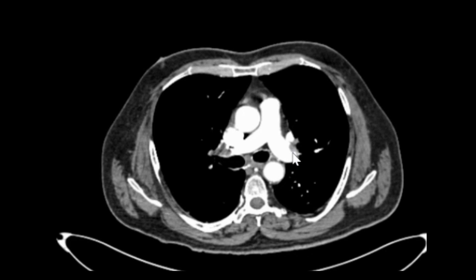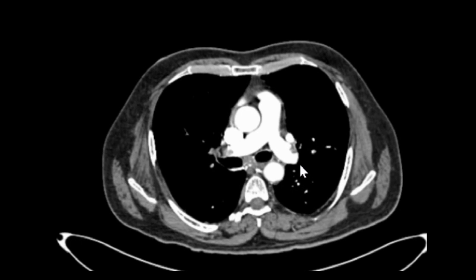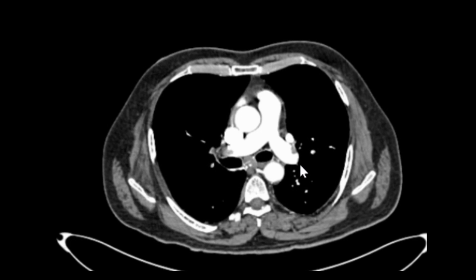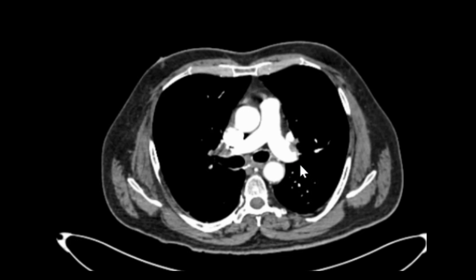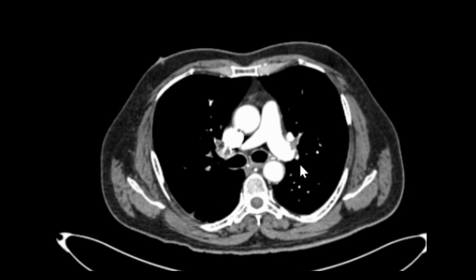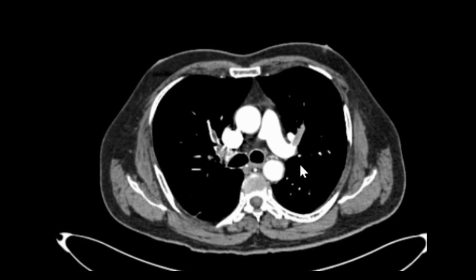Also in the left pulmonary artery, near the wall of the arteries, these are non-enhancing filling defects. As we move down to follow the branches of the pulmonary arteries, these branches are almost completely filled with that filling defect.